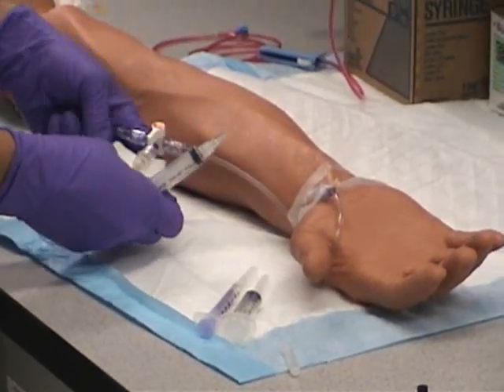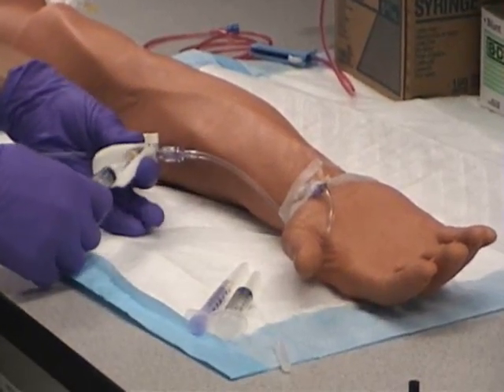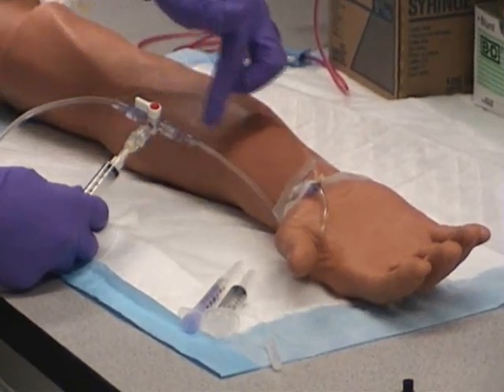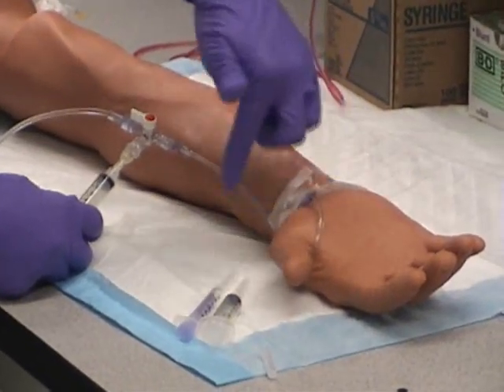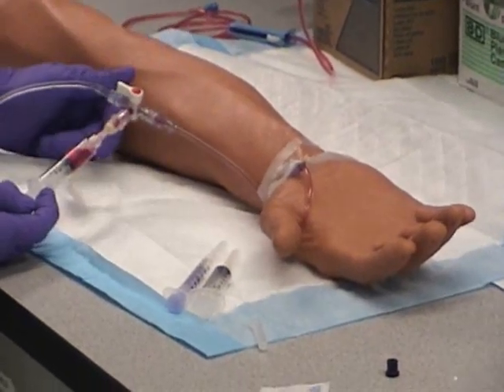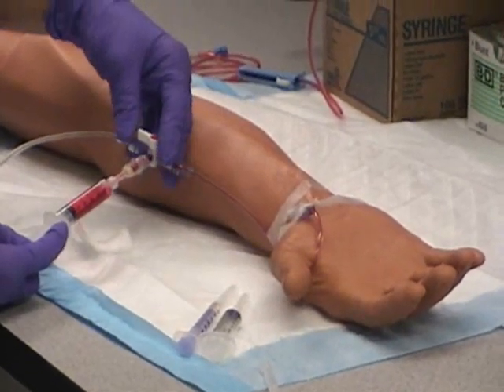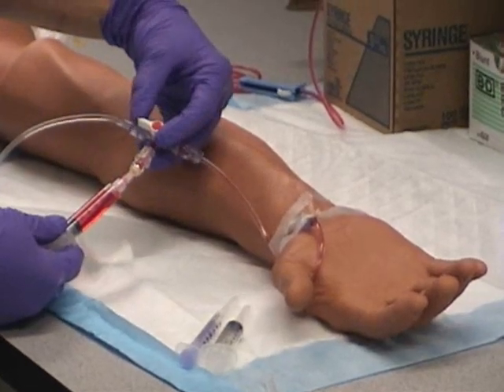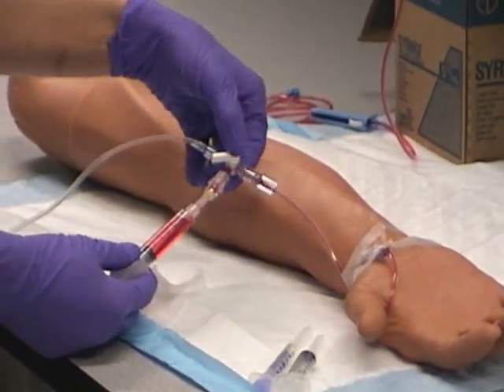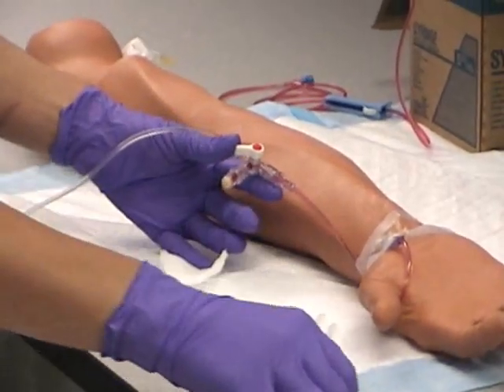After 30 seconds, insert your first waste syringe. Right now the port is off to the sample port. Cover with gauze around it because it might squirt a little fluid out at you. Insert the syringe and change the port off to the system. What we're doing is taking the heparinized fluid out of the tubing and withdrawing blood. Withdraw slowly — you can see the blood in the line — and withdraw about 5 mils of waste to allow a pure blood sample in the line. Once you've withdrawn the 5 mils, turn the stopcock off to everything — halfway between either side port — which closes all three ports. Cover with gauze, withdraw the syringe, and set it aside. We will discard that properly later.